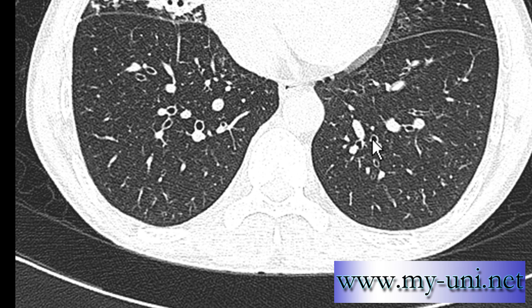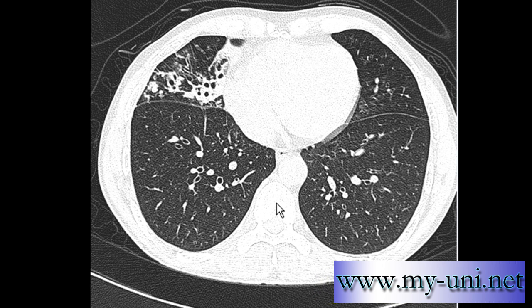This is a pulmonary artery, bronchial branch. Pulmonary artery, bronchial branch. This is likely to be a pulmonary vein. Now, it is really not advisable to comment on one image — you have to see a whole set of images before you comment on any anatomical structure or pathology. But we'll assume these are all blood vessels. Sometimes you can see a bronchus running behind or above it, but with just one image we're assuming there's no bronchus in this area.